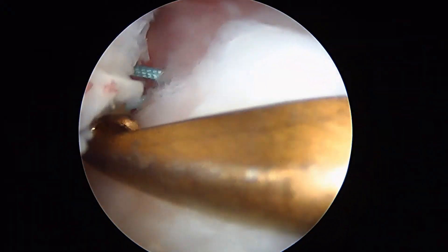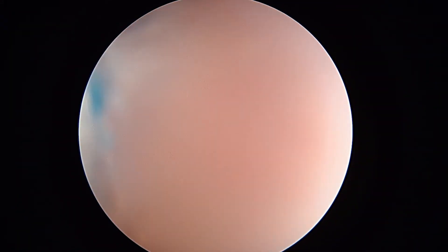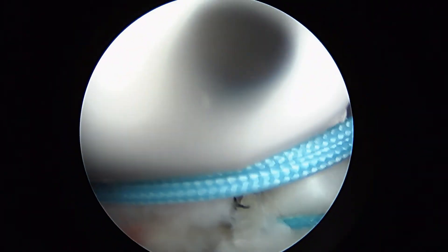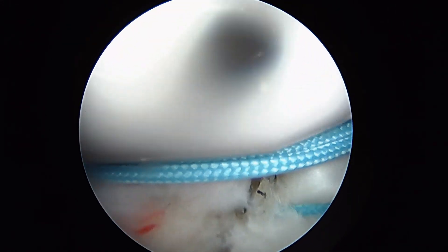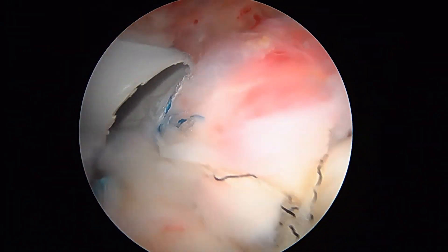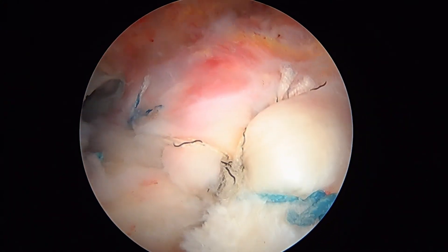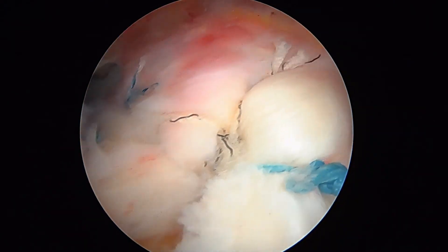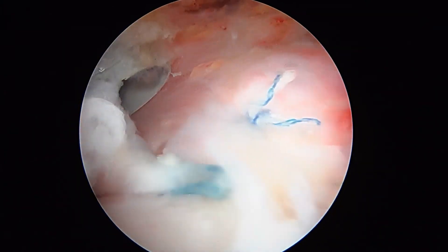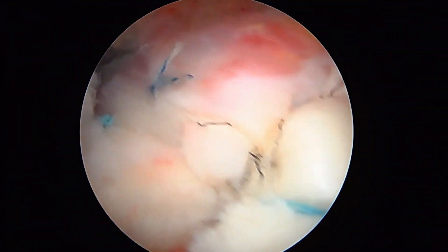We've got all the sutures in for the cuff repair. The last two you see here are for the biceps tendon — we're going to reach in and tie those now. We've tied the bicep suture — that's the solid blue one right there. I'm going to rotate your arm, and you'll see how your tendon moves as a very solid unit. We've got a ripstop stitch in, three sutures tied from an anchor — see how that one goes over the ripstop. As we rotate, that looks very good. I'm very happy with the way that looks. We're going to finish up here and get you back to the recovery room. Good luck to you now.